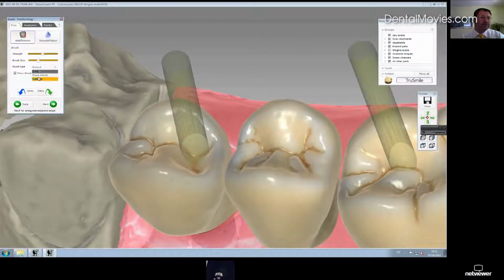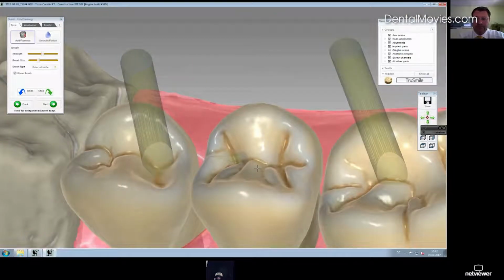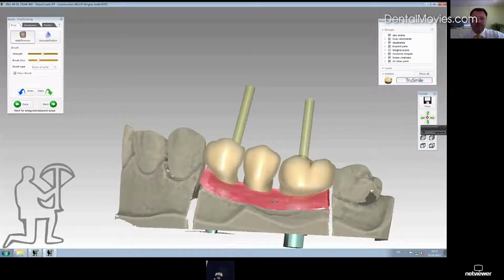Or you can freeform it with the wax knife, add material or smooth this area a bit. And here you can choose different forms. So it's round, that's default. A knife, which is like a spike, and a cylindrical form. And here on the knife, you can go on with these parts and freeform the whole tooth.